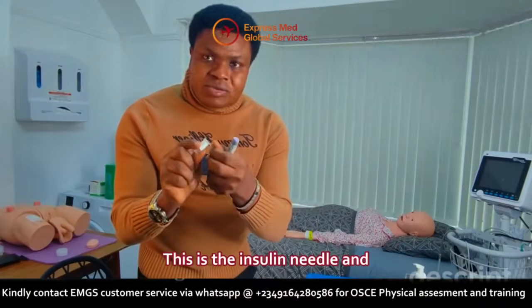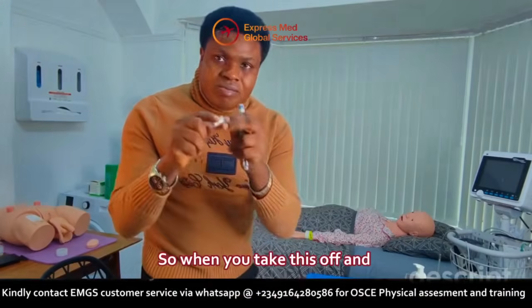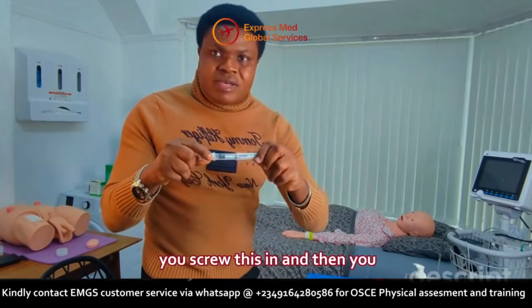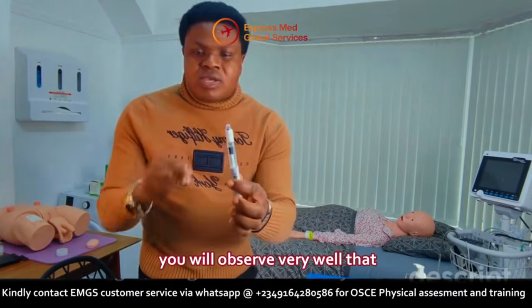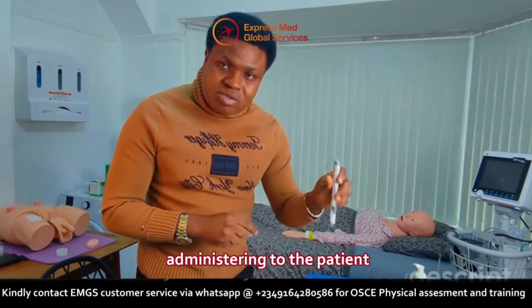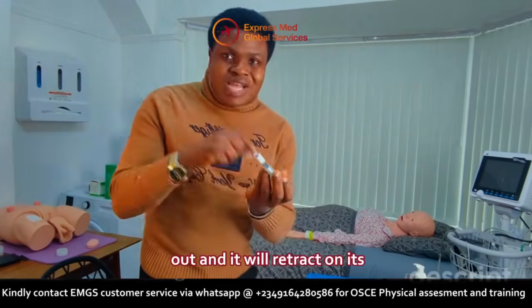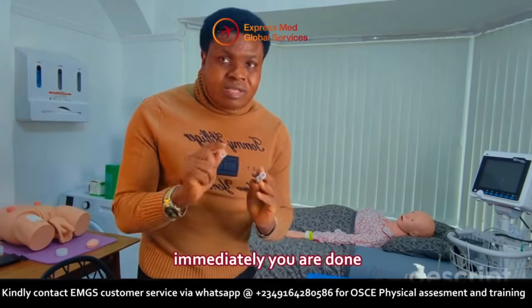This is the insulin needle, and the expiring date will be somewhere here. When you take this off and then screw this in, observe, you screw this in and then take the cap off, you will observe very well that you cannot see any needle anywhere. You can't see any needle anywhere. But by the time you are administering to the patient, obviously the needle will come out and it will retract on its own and activate its own safety lock immediately you are done.